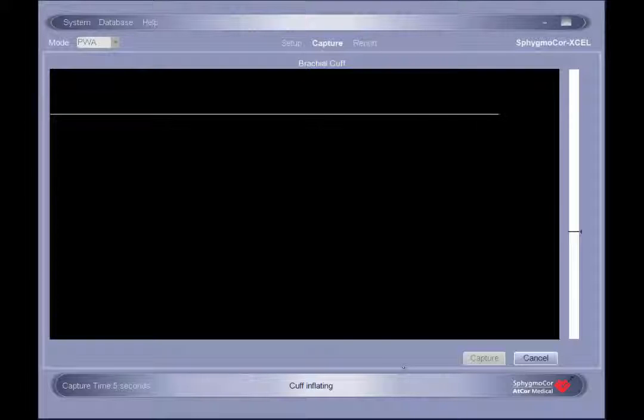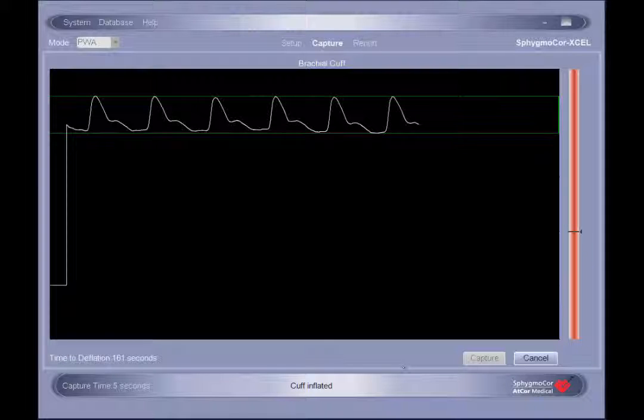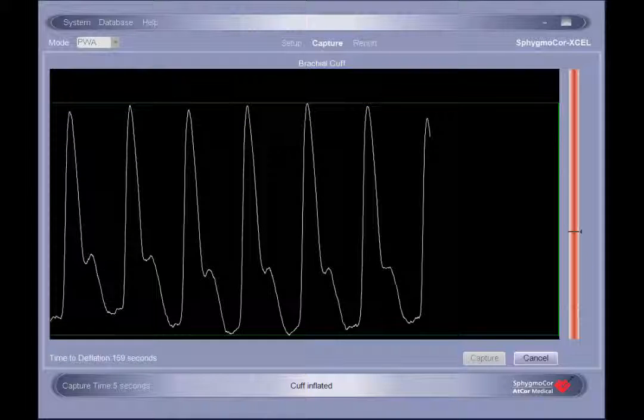Once the cuff completes inflation, it will remain at the determined pressure and record the waveforms generated from the brachial artery. During waveform acquisition, the guidance bars evaluate the signal to provide information about the consistency and amplitude of the waveforms. The horizontal bar at the top of the tracing evaluates the consistency of the waveform peaks. The horizontal bar at the bottom of the tracing evaluates the consistency of the baseline, and the vertical column to the right of the capture screen is an indication of the signal amplitude or strength.